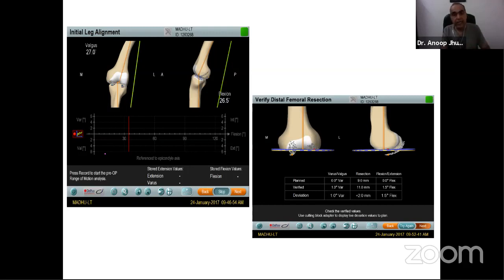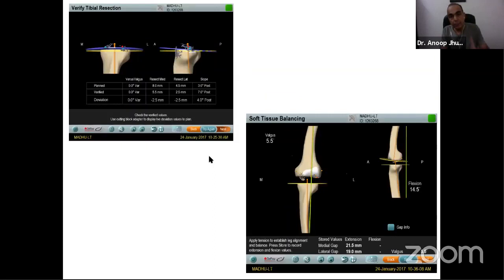That's one thing. Now, this is a flexion deformity of 27 degrees. You can see distal femur cut. We just taken a +2, not more, and we'll come to that. Tibia cut, we have taken a 7 or 8, not much, because these knees tend to open into flexion, the valgus cases. And this is FFD, so we have taken a +2 on the femur.